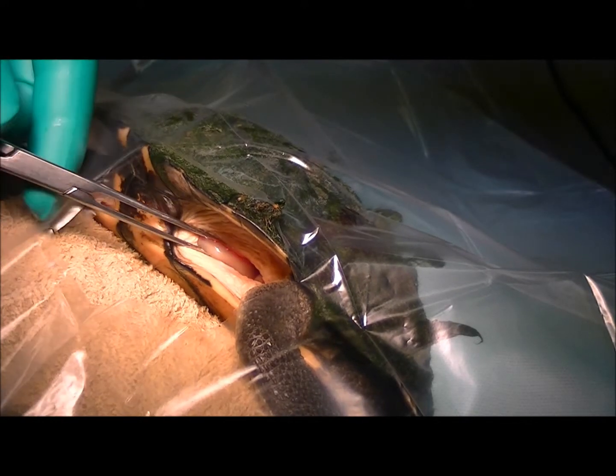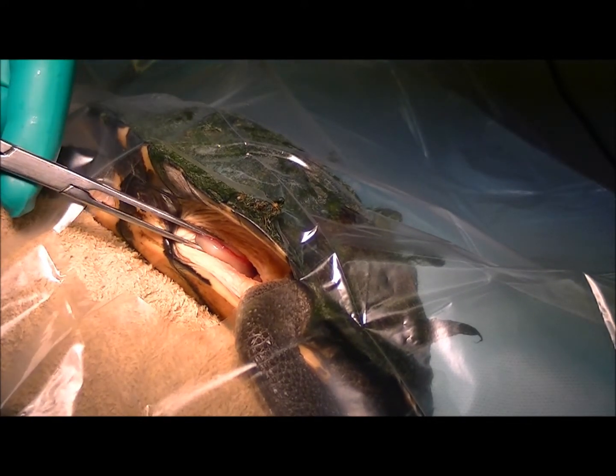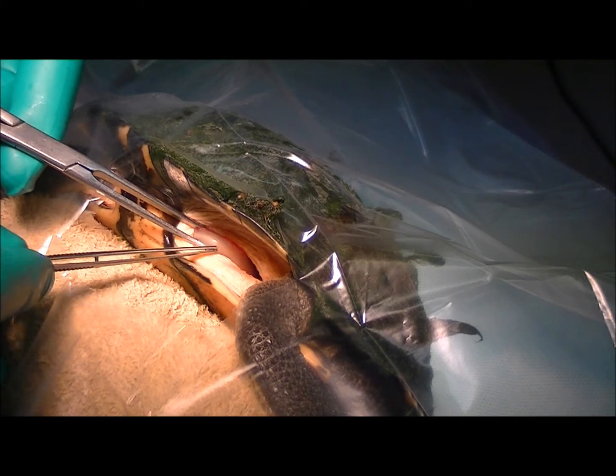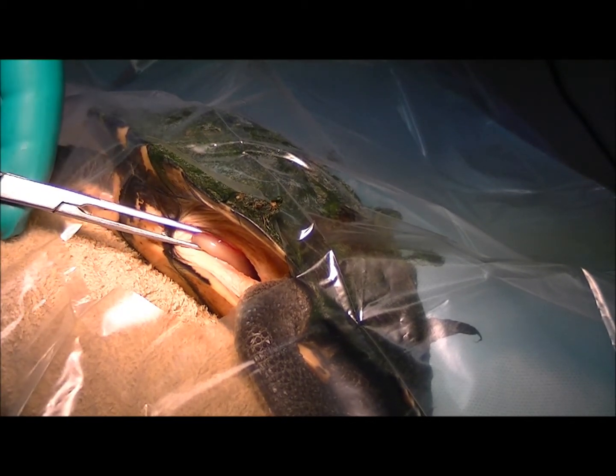So I've just gone into the abdominal cavity and had a bit of a look around, and you can see here I'm holding onto this pale tissue — that's actually the wall of the stomach. So I'm going to make an incision just here; there's a little blood vessel here I'm going to avoid. We'll make an incision just along this side, and then we'll have a feel around — we should be able to get that hook out and stitch her up.